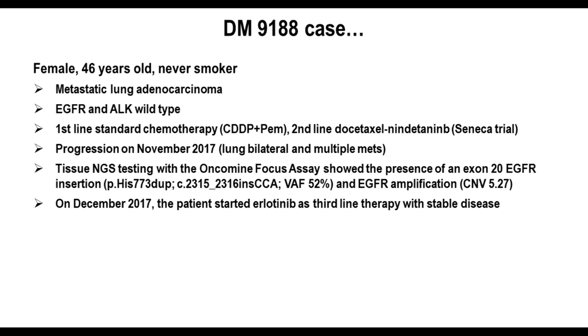Now, this is not the only case in which we receive samples that have been tested with routine diagnostic kits, and when we go back to target sequencing, we find EGFR mutations that were not detected. I think this is actually very important, to use target sequencing testing for the EGFR mutation.